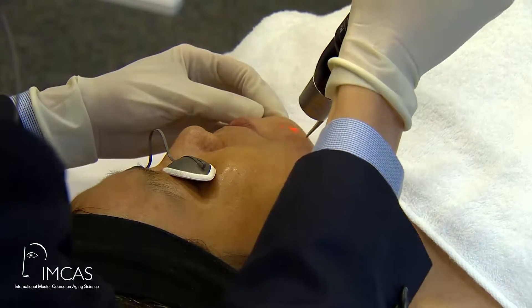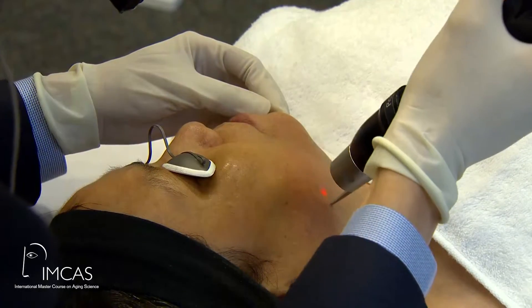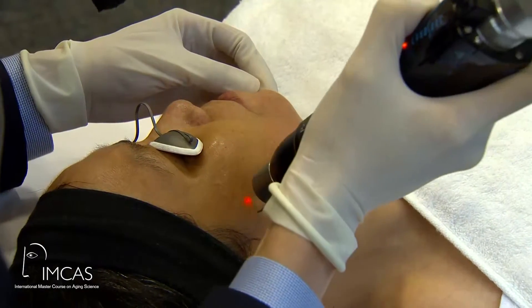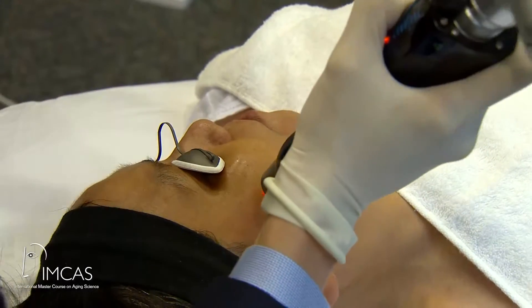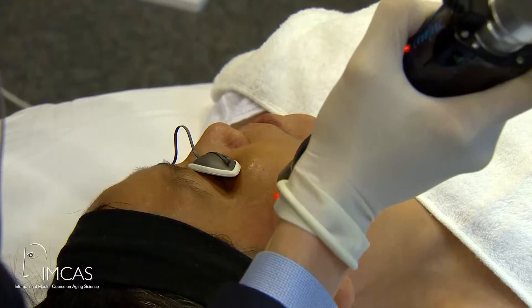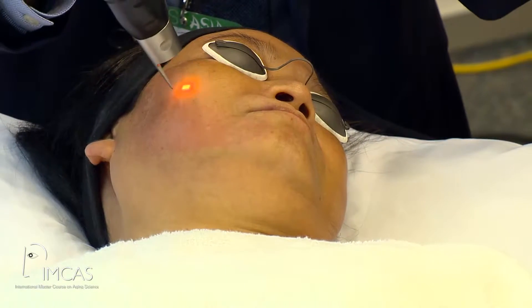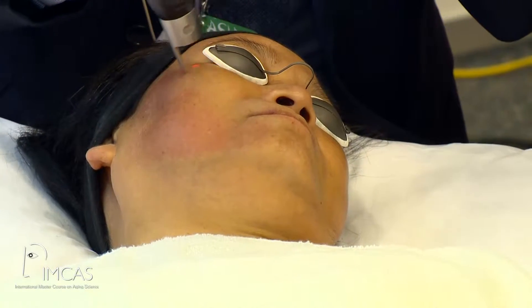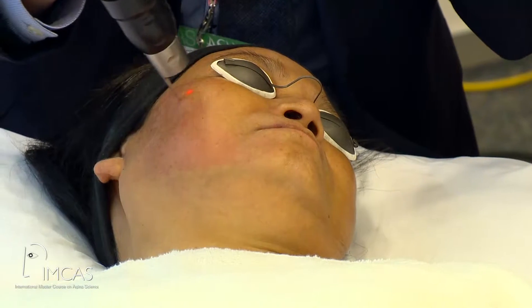We avoid the risk of PIH like this. The most difficult part of a laser treatment is not the technique itself, but rather the decision-making. The big question for this kind of patient is whether we cross those lentiginous lesions or not. For this patient, I would not. Although we know that crossing and peeling off one week later would give us a faster result, because she is not too good with sun protection and also has melasma and a dark skin type — although PicoSure has a much lower rate of PIH even if you do crusting — I would not take this risk.